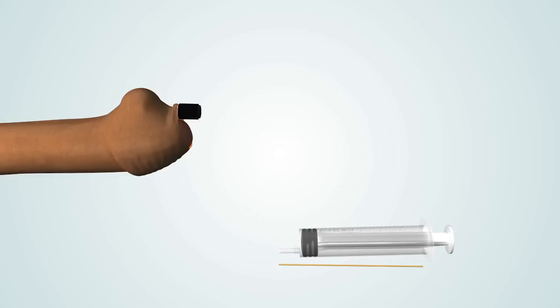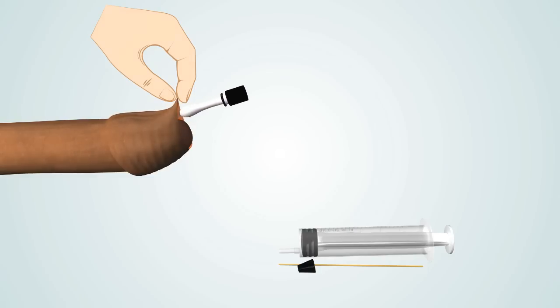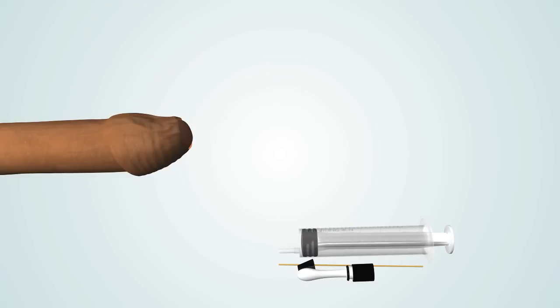Leave the inflated balloon in position for several minutes, or as long as comfortable. To remove the NovoGlan device, simply remove the NovoGlan device plug and allow the balloon to deflate. Then gently remove the NovoGlan device from under the foreskin and place it in the plastic container.